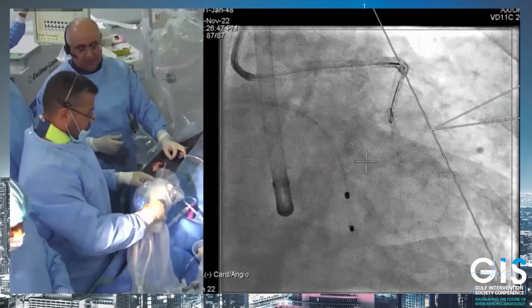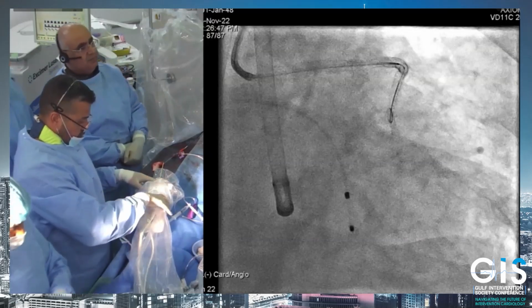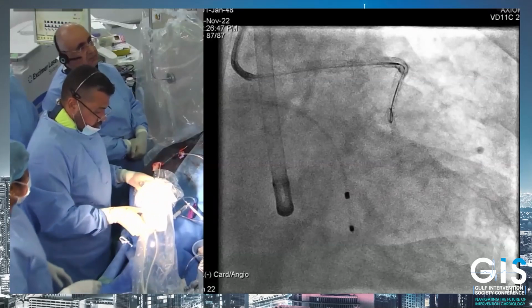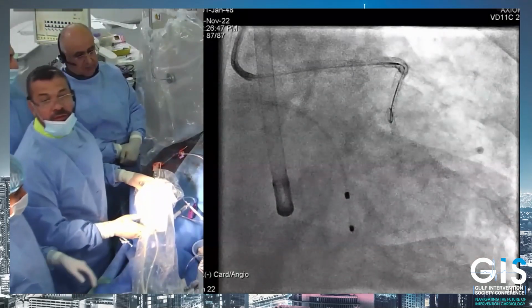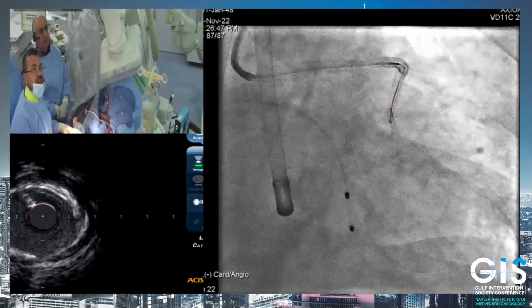Me personally, I'm not happy with the ostium and the proximal circ. I mean, considering this patient is not a surgical candidate, you want to make sure that all his vessels, especially his left dominant, that you don't miss anything.